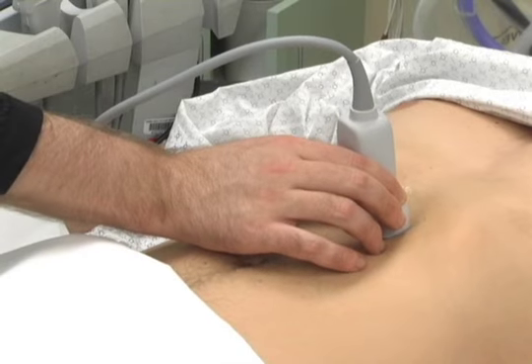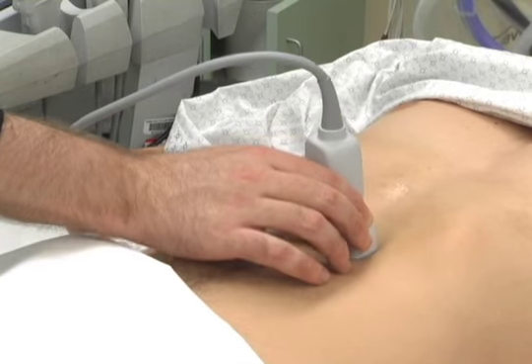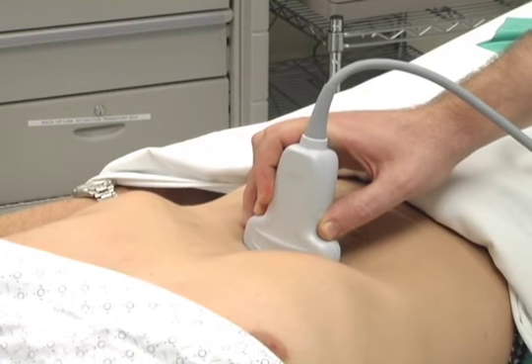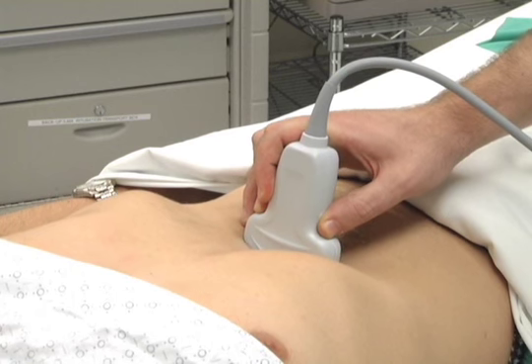Bowel gas causes scatter artifact and is the most common obstacle in adequate visualization of the abdominal aorta. Throughout the exam, moderate steady pressure may be required to disperse overlying bowel gas.